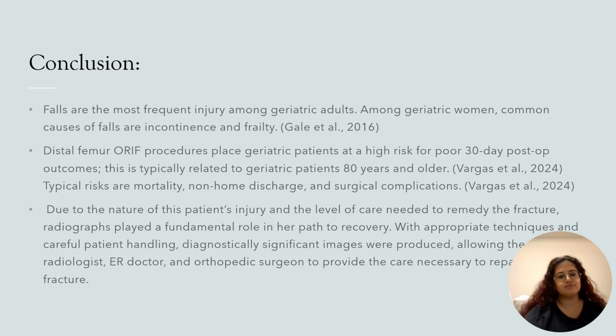Due to the nature of this patient's injury and the level of care needed to remedy the fracture, radiographs played a fundamental role in her path to recovery. With appropriate techniques and careful patient handling, diagnostically significant images were produced, allowing the radiologist, ER doctor, and orthopedic surgeon to provide the care necessary to repair the fracture.